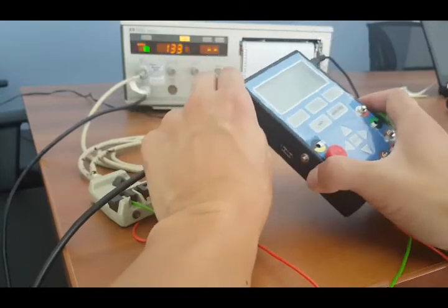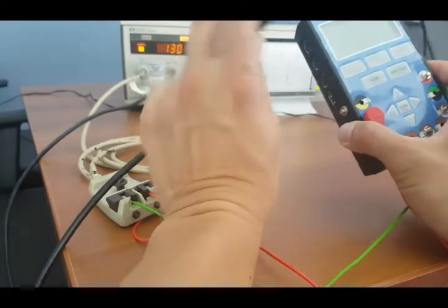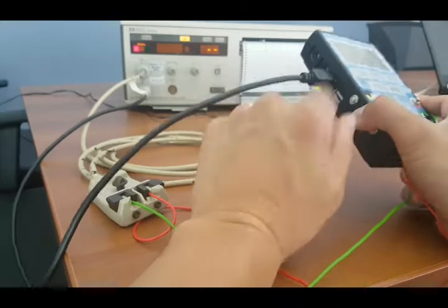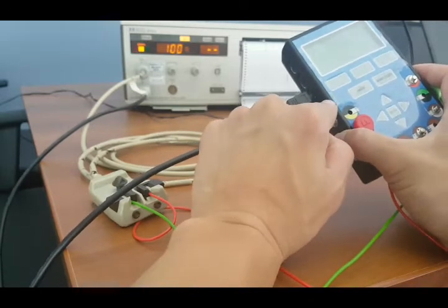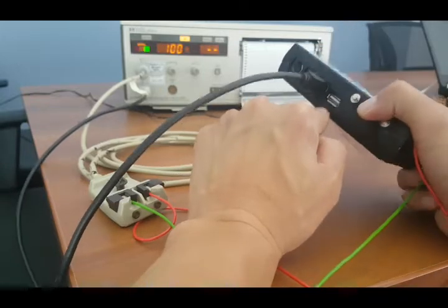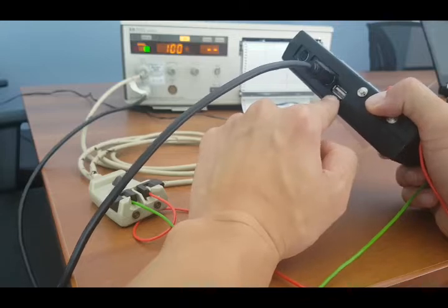Now I'm ready for my next demonstration, which is connecting to the TOCO port. I will reconnect my ultrasound port into US1. Normally, especially for your monitors, I believe you will be using the IUP/Toco USB port here on the bottom. Now, this is not a USB that you would connect into your computer.